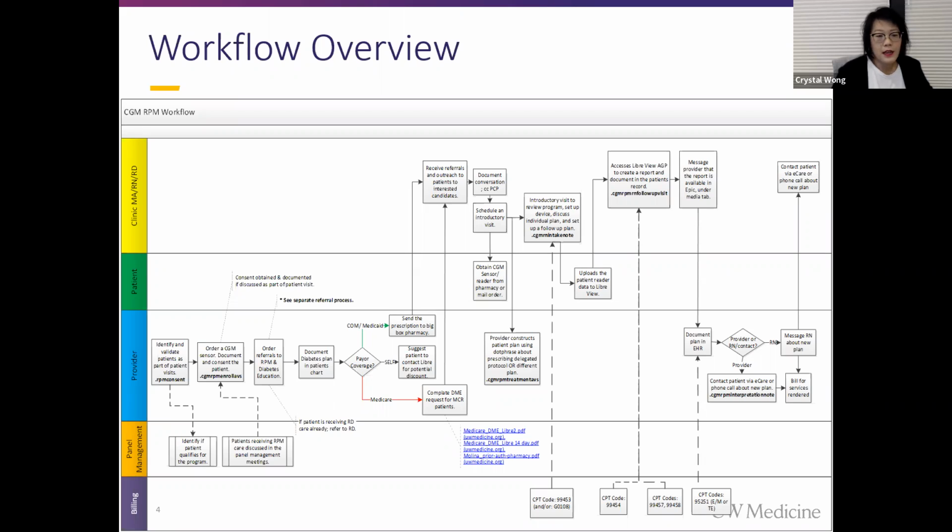One thing we definitely enhanced after we ran the pilot is this section right here around what happens behind the scenes to get the patient their equipment. That was really valuable learning from the pilot. It can be a little bit complicated, as we know, trying to get things covered for some of our payers, such as Medicaid or Medicare. So we put a lot of work into this workflow so that hopefully it decreases barriers to patients actually getting their equipment.